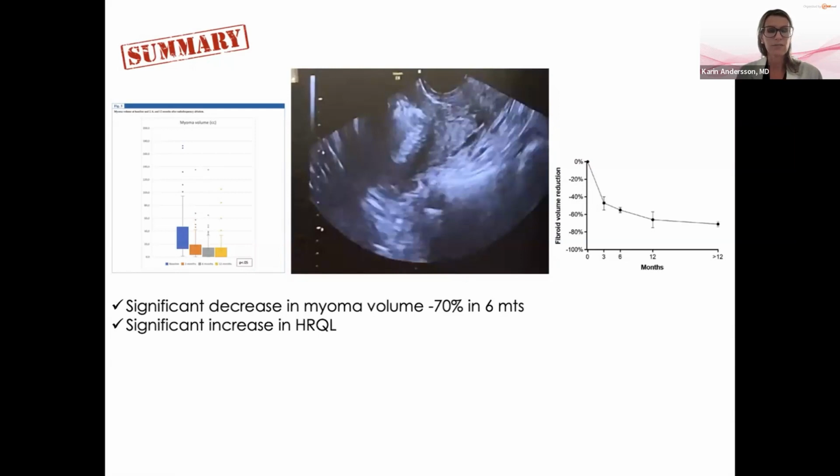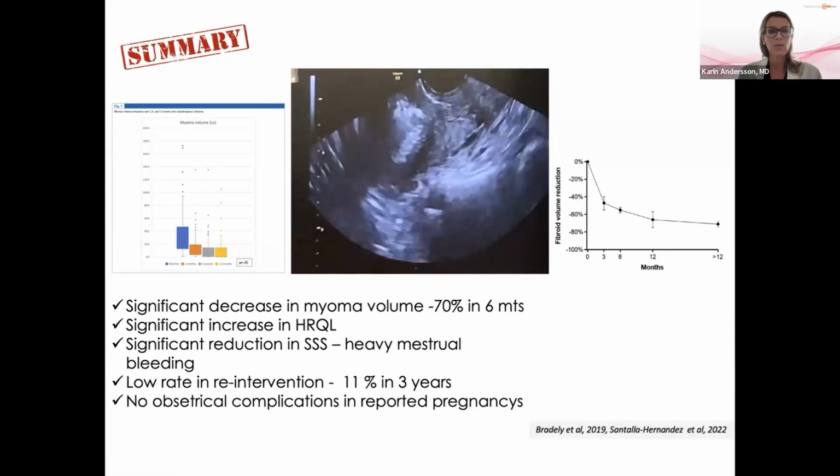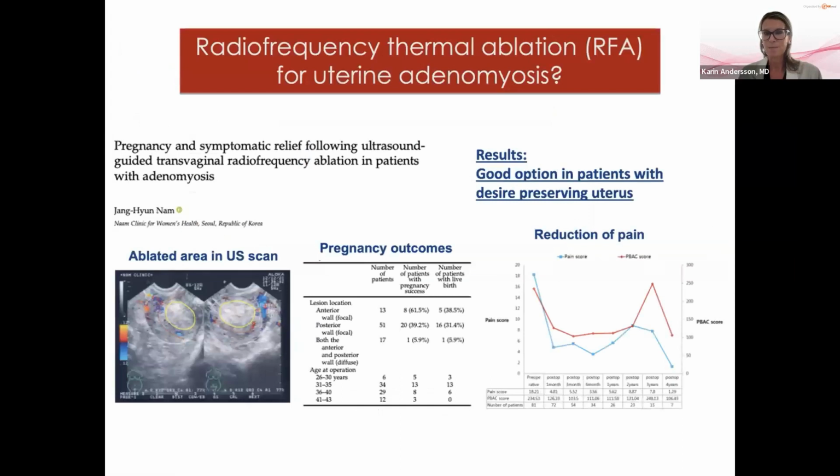And we do have an increase, like I said, in the quality of life, mostly due to the less bleeding of the intramural fibroids, and the symptom severity scale. Also, not only the days, but also the heavy menstrual bleeding is decreasing. A low reintervention rate, 11% in 3 years, has been reported, and no obstetrical complications in reported pregnancies. So this is what we know up till today in regards to the fibroid area.